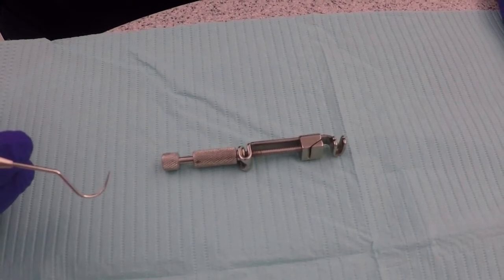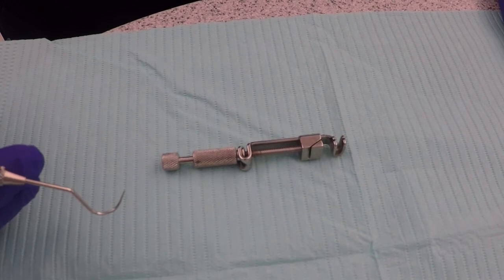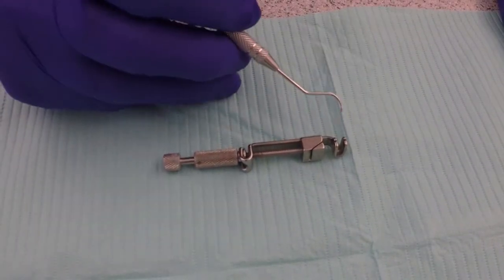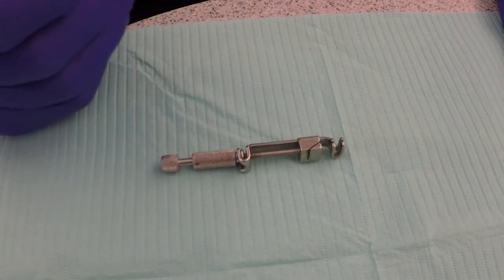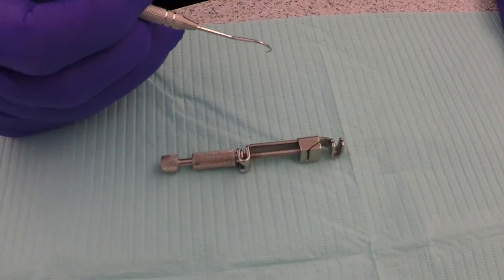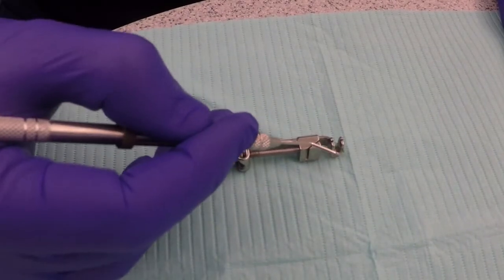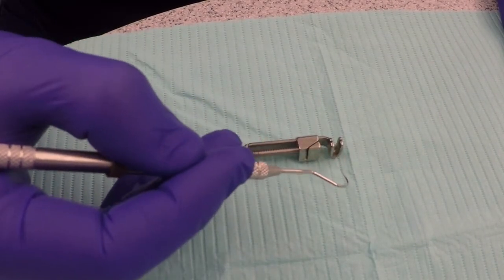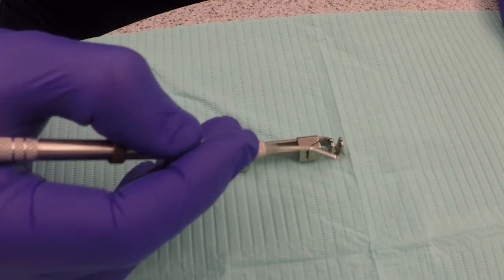Once the matrix band has been burnished, we can identify which guide slots to put our band through. If we are restoring a tooth in the mandibular right quadrant or the maxillary left quadrant, we will use the left guide slots. If we are working on the mandibular left quadrant or the maxillary right quadrant, we will use the right guide slot. Since number 19 is in the mandibular left quadrant, we will use the right guide slots.